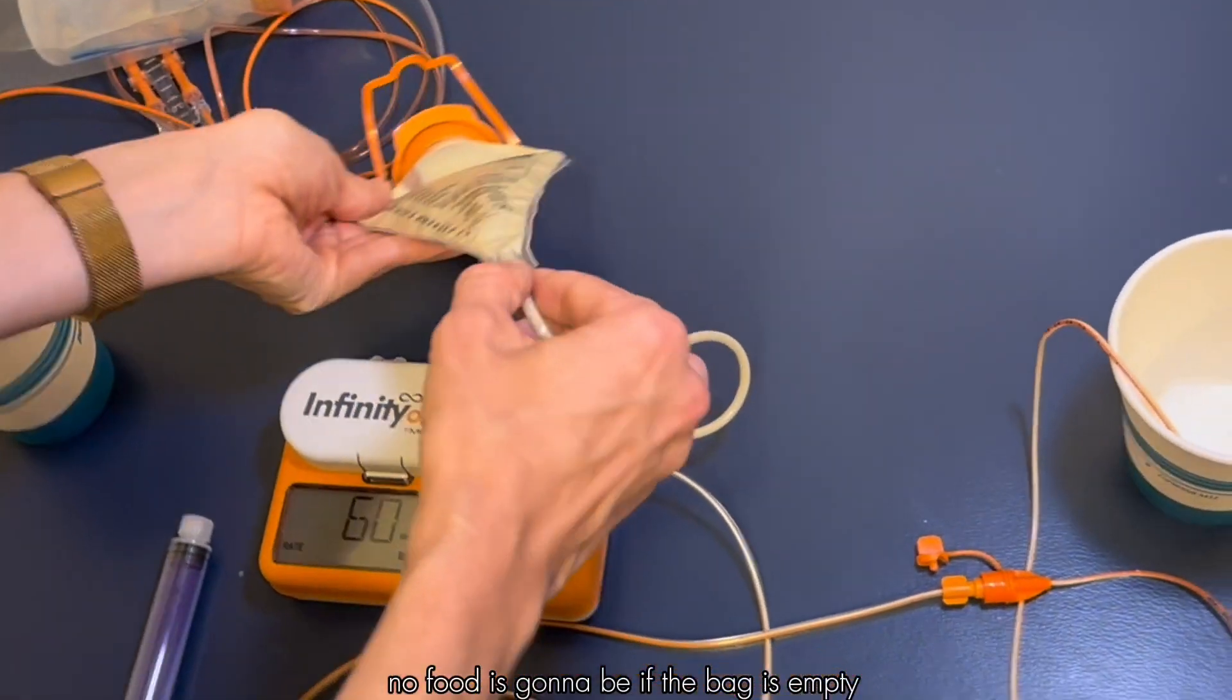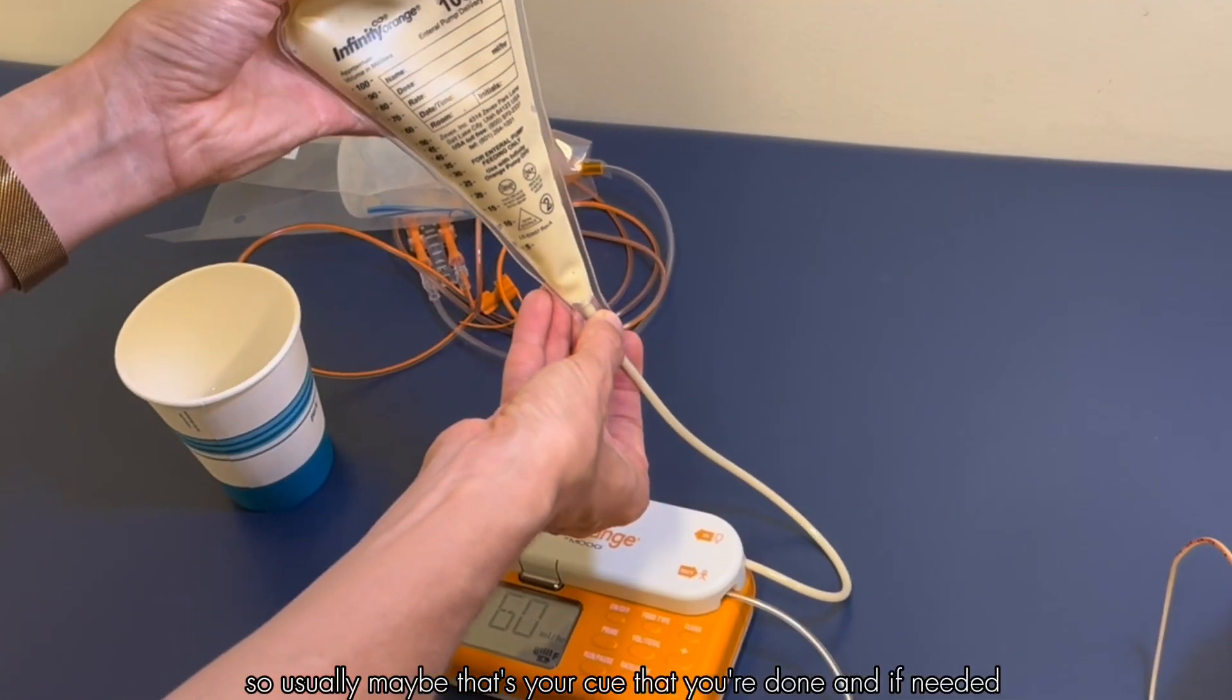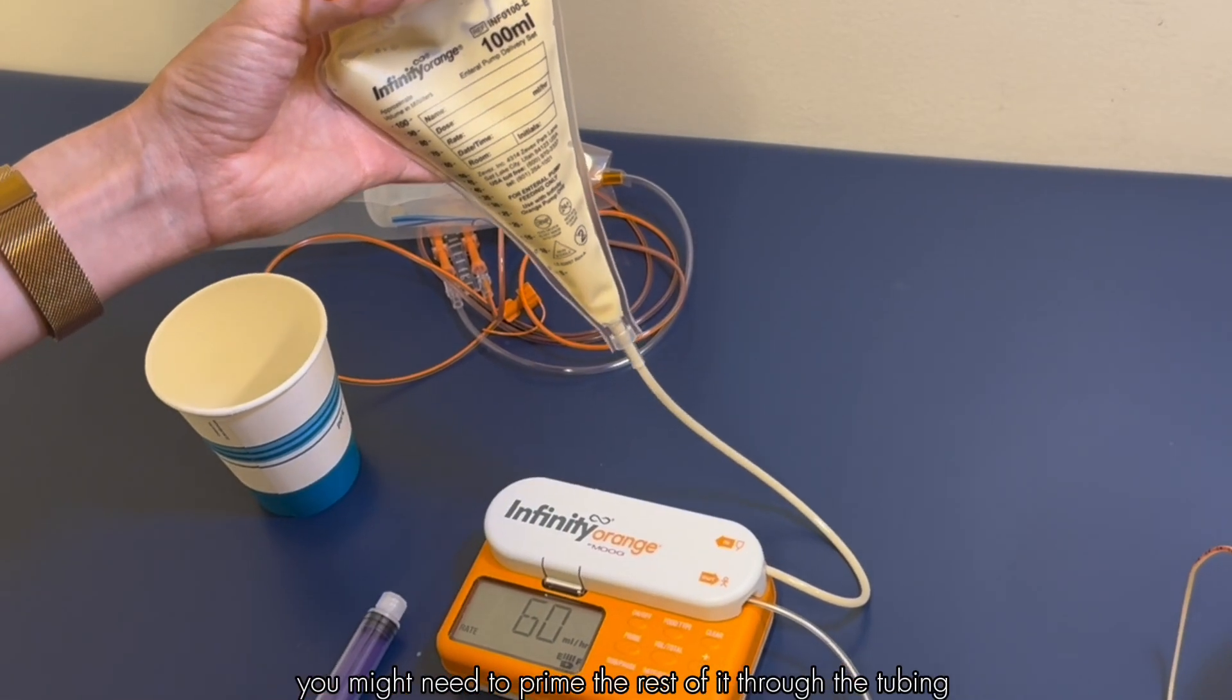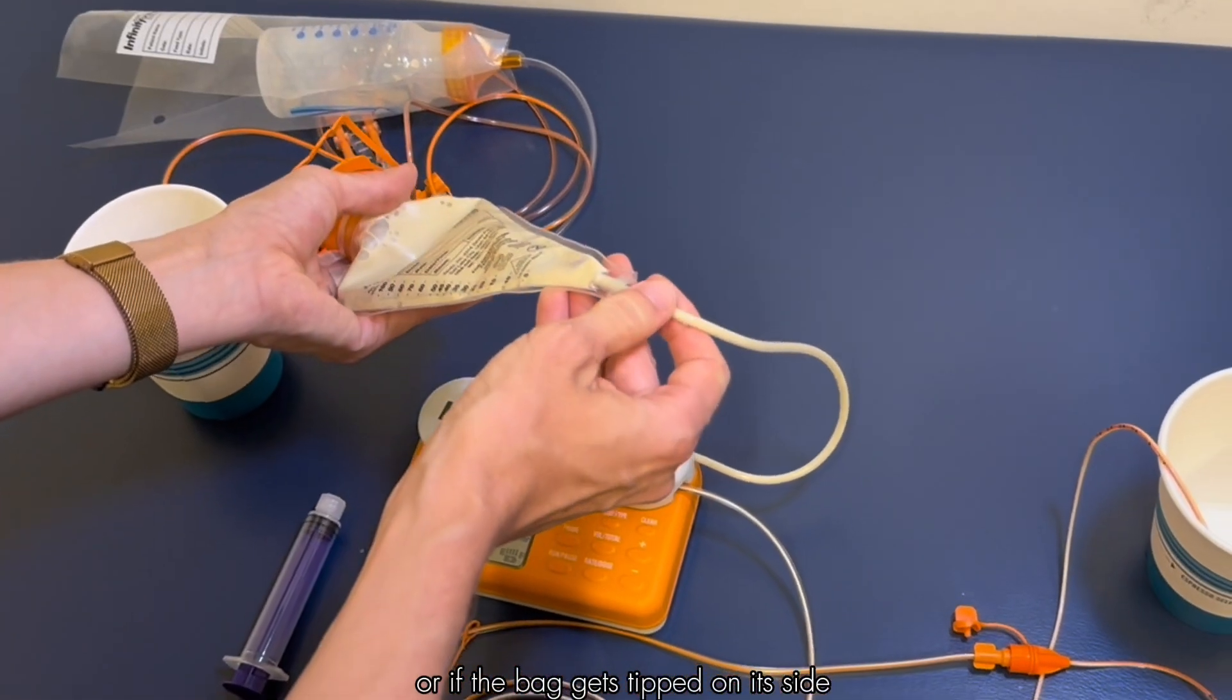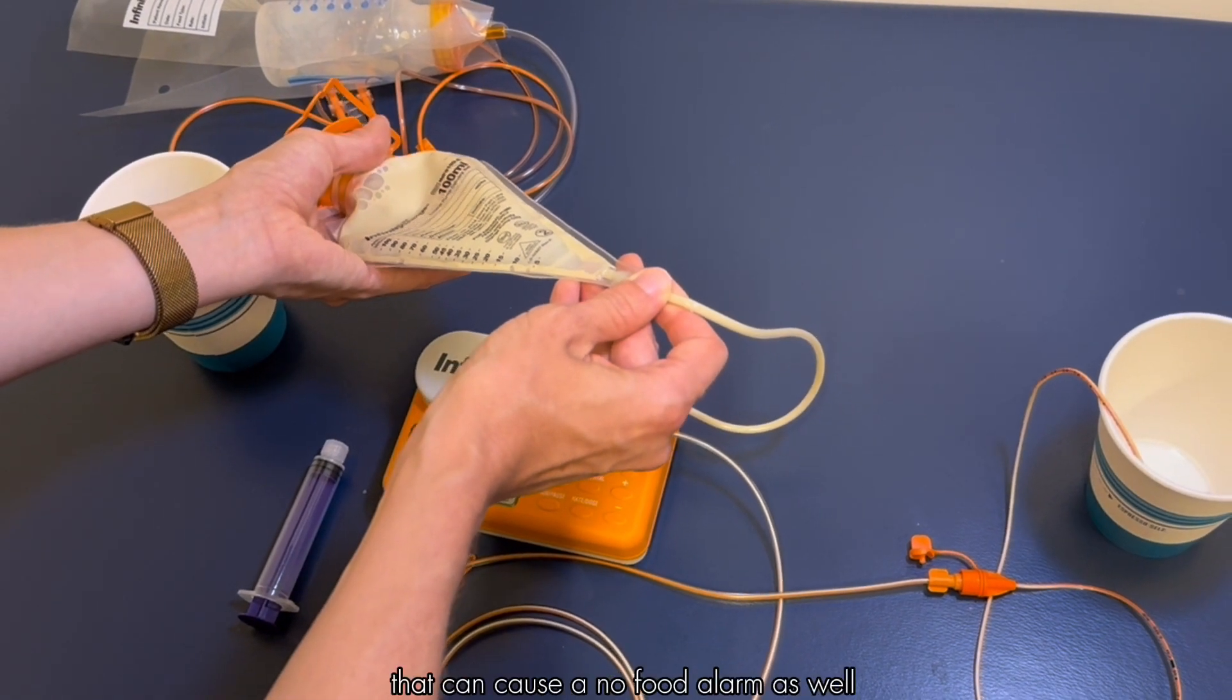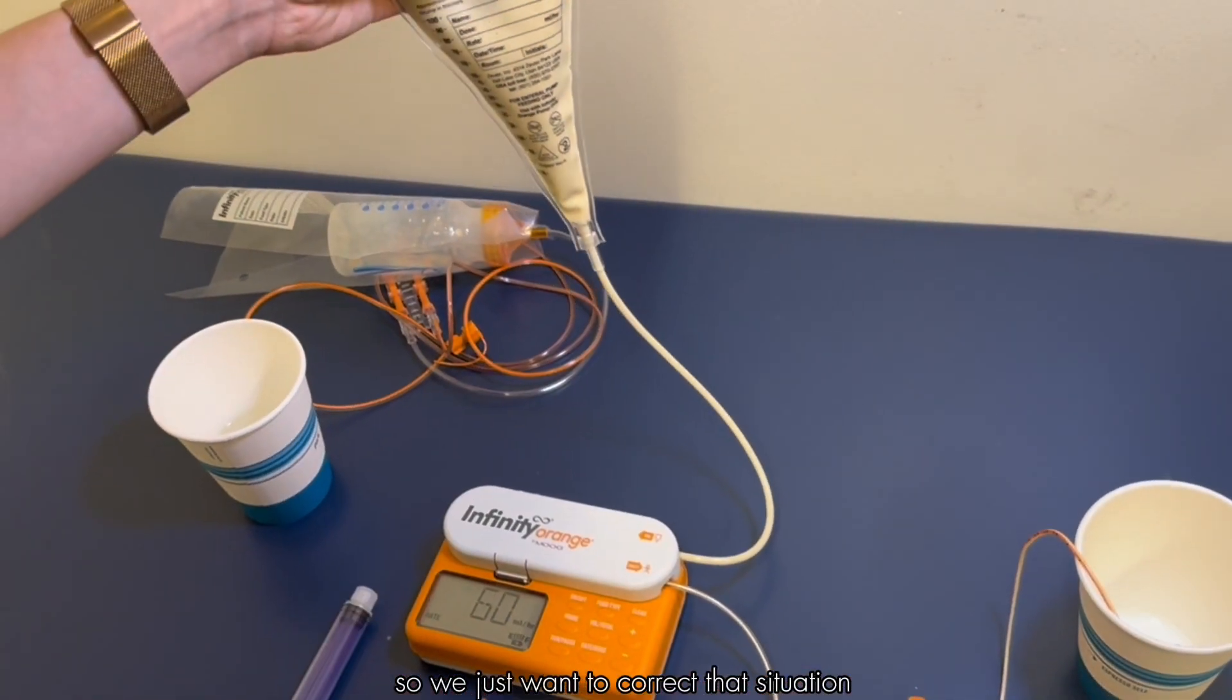No food is going to be if the bag is empty, so usually maybe that's your cue that you're done and if needed you might need to prime the rest of it through the tubing. Or if the bag gets tipped on its side and air starts going through the tubing, that can cause a no food alarm as well. We just want to correct that situation.